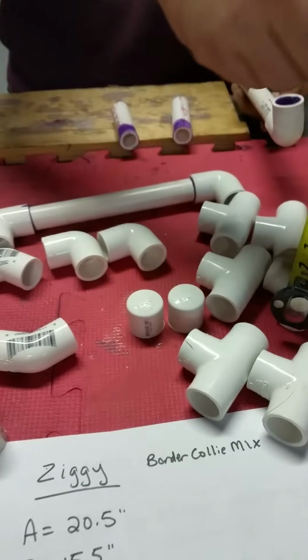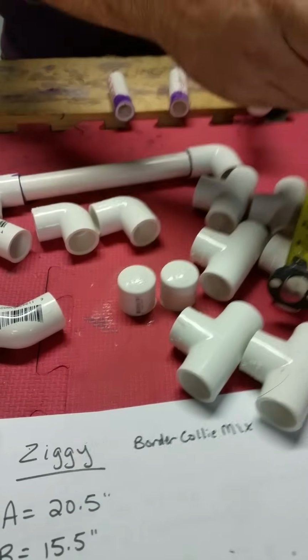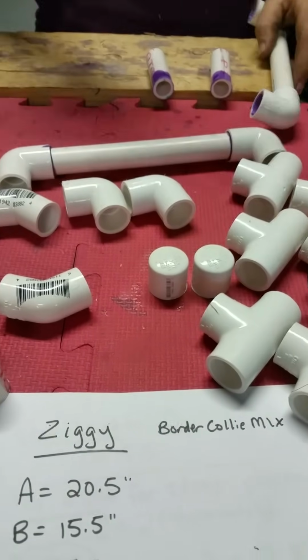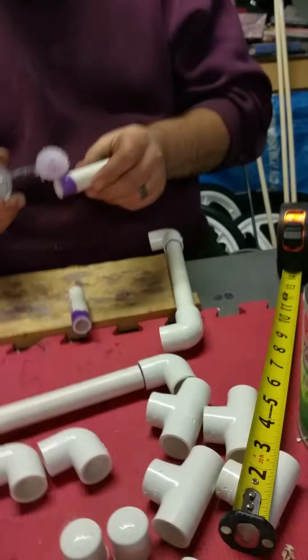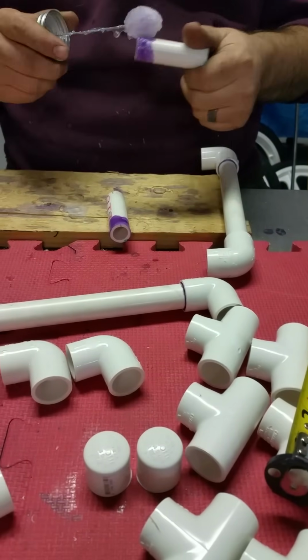So we've primed the ends of the 2 3/4 inch pieces and the inside of the 90-degree pieces, and we're going to be making the back assembly of the cart.